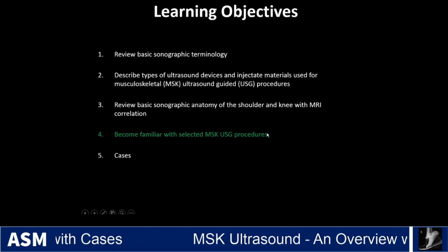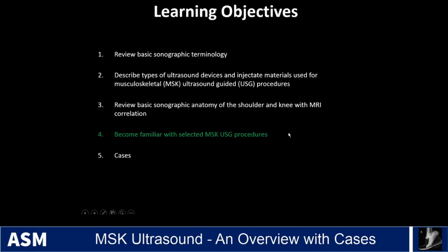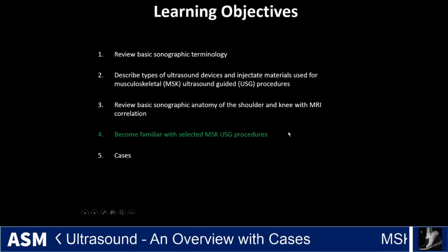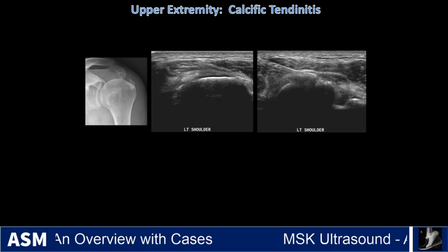So now I'm going to get into the part where I'm going to talk about some of these common MSK ultrasound guided procedures, and I'm going to pause just to at least give a second if you want to pause your screen to look at some of the evidence that I presented, but I'm not going to go into a deep discussion on the evidence because that's really outside of the scope of this.